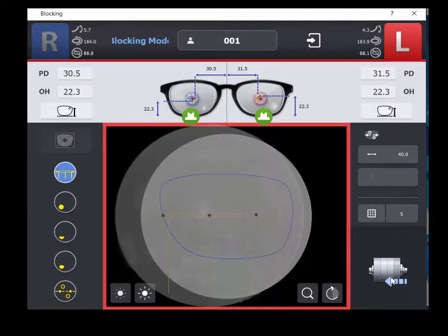Once both lenses are blocked, select the send to edger icon. This will transfer the block job to the edger.